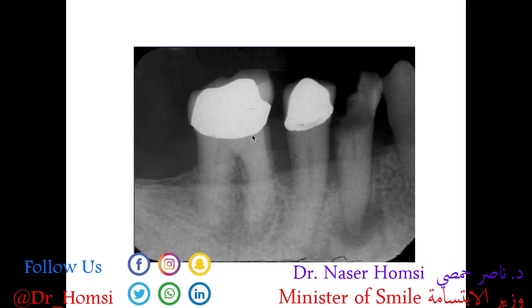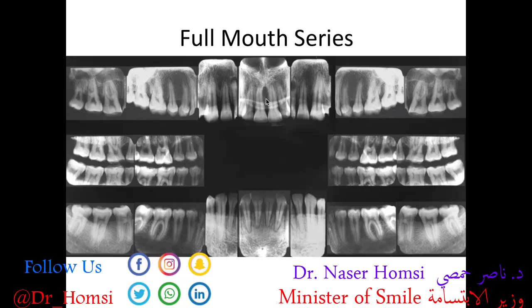In this periapical we see two extremely radiopaque structures — these are actually crowns, specifically porcelain-fused-to-metal (PFM) crowns, where the extremely radiopaque area is the metal substructure and the slightly less radiopaque area above it is the ceramic outer layer. We also see a really large cavity that's invaded through the enamel, through the dentin, all the way to the pulp, causing infection in the bone and manifesting as a radiolucency — an abscess.